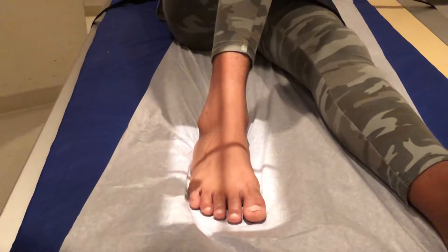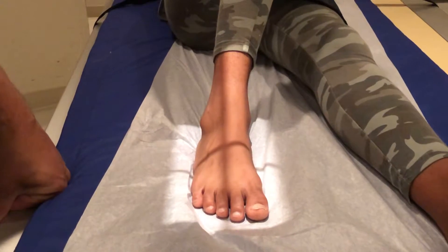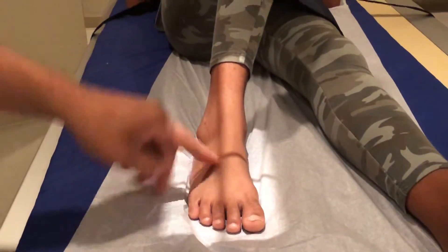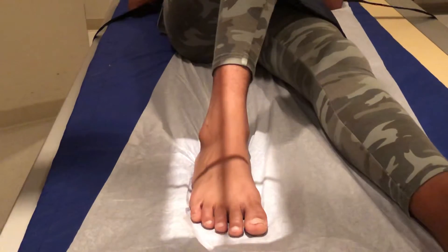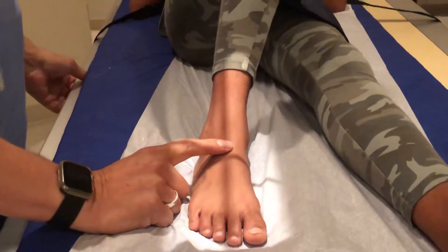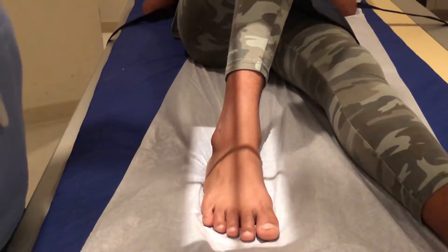For the AP, you want to put an angle of between 10 and 15 degrees on the tube, cephalad, to make sure that you hit the metatarsals at a perpendicular angle — a 90 degree angle. So you're going to angle up a little bit. You're going to center right about here, kind of at the base where the foot and the ankle meet, that junction there.